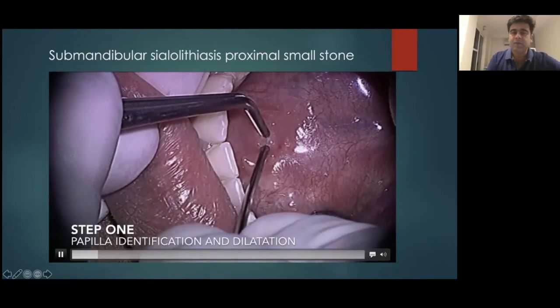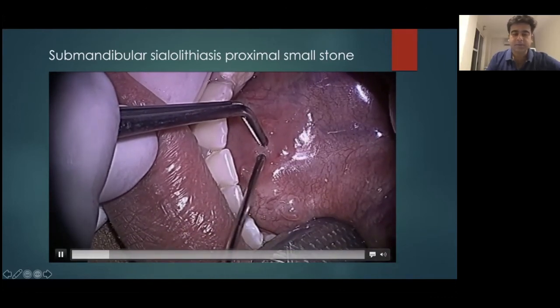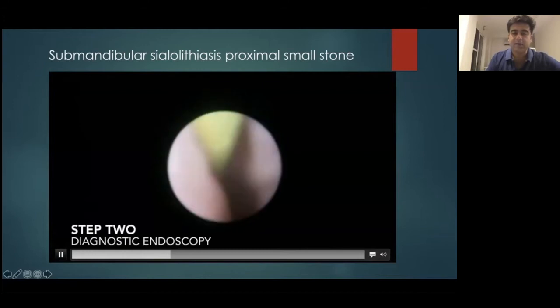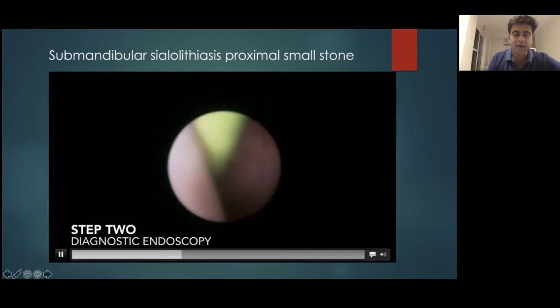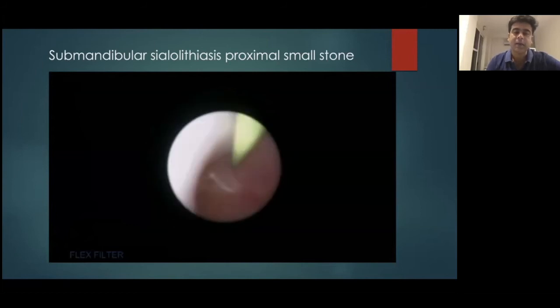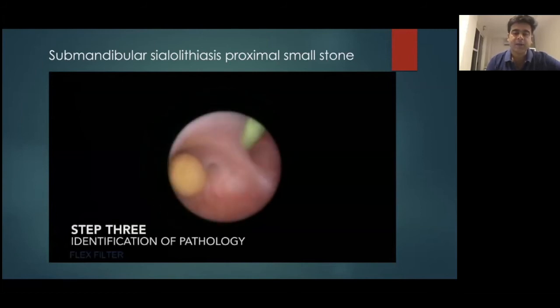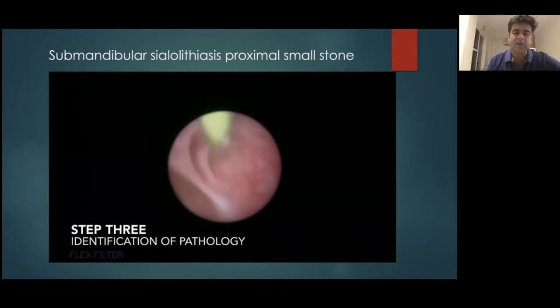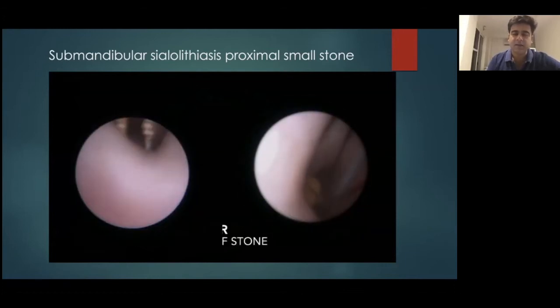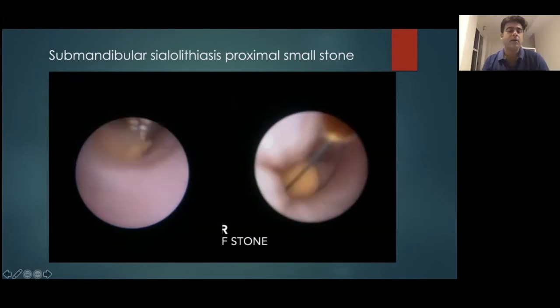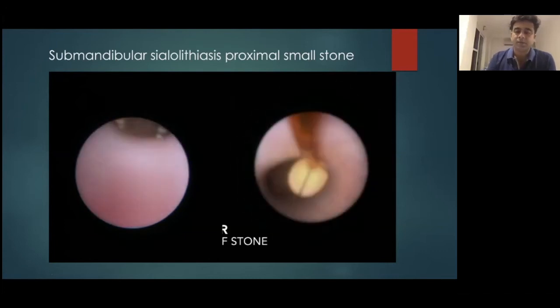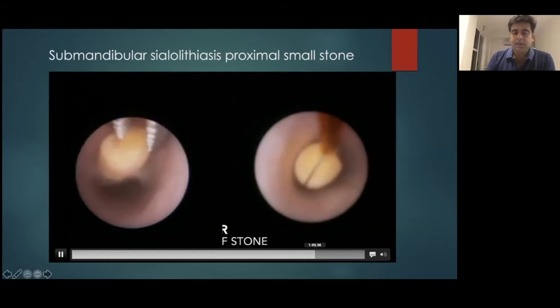Now comes a case where the endoscope is really invaluable — a proximally located small stone. The endoscopy is done over a guide wire — the greenish thing you can see — which guides us to the end of the duct. We see a pathology just past the primary branching duct, technically within the gland. Once we see it, we can use a forcep or a basket, take care of the obstruction, bring it right out, and deliver it through the natural opening — no incisions, no scars, no problems.